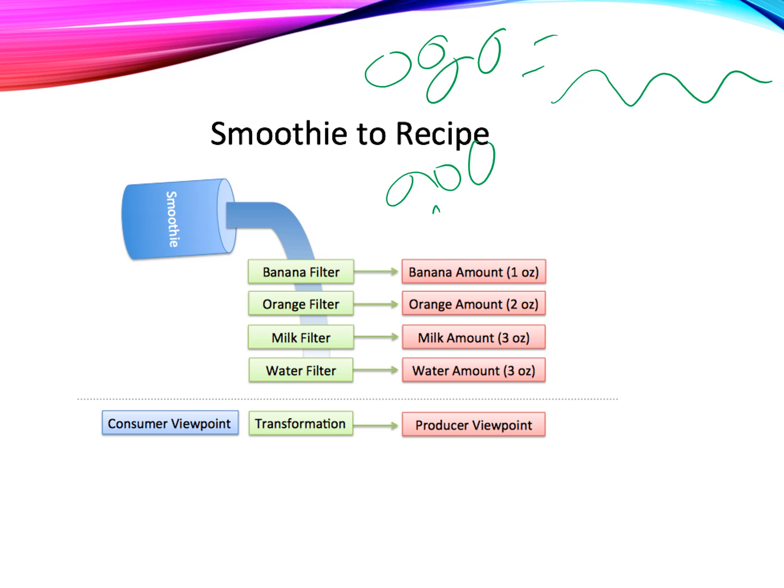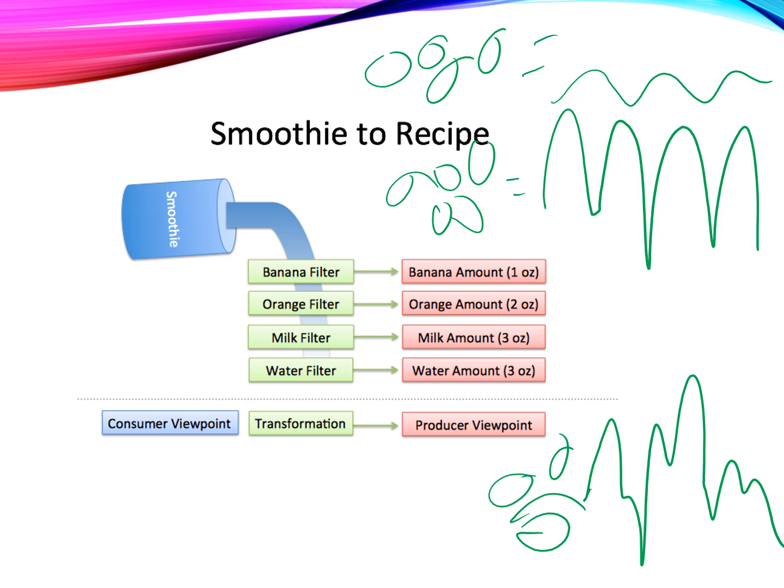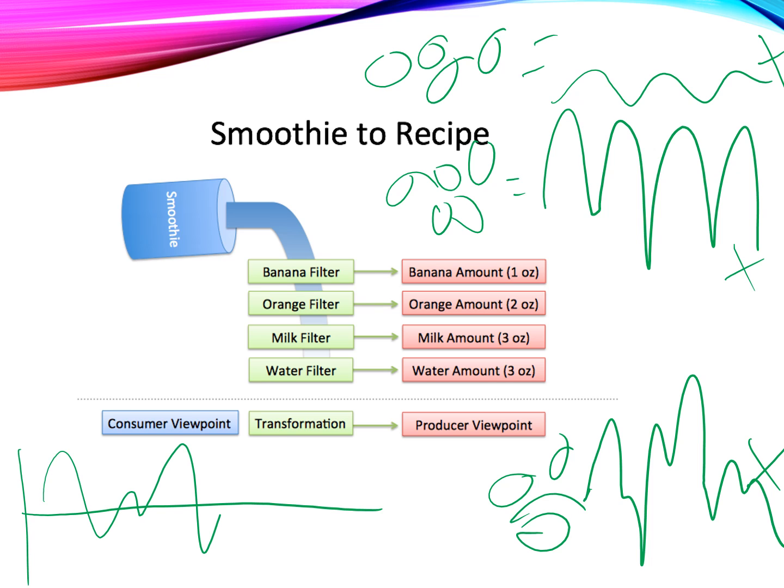And then this group of blood cells is sending back something like this. And then this set of blood cells is sending back something like this. So the fast Fourier transform is going to take all these components of our recipe, add them together, and give us what we expect to see. It's kind of a filter of sorts to give us a nice waveform in the end.